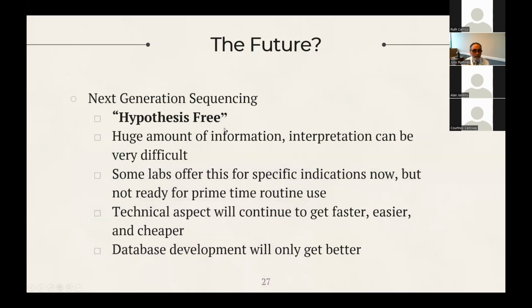What that means is I don't have to think, could this possibly be a fungus? Could this possibly be an aerobic bacterium? Is this an anaerobic? The physician does not have to think ahead of time about what bug might be causing it because this will pick them all up. If you have a parasite in there, it's going to pick that up. If you have a virus, it's going to pick that up.